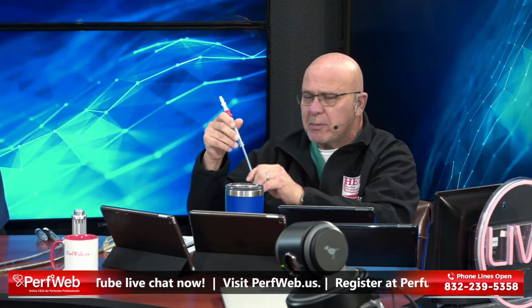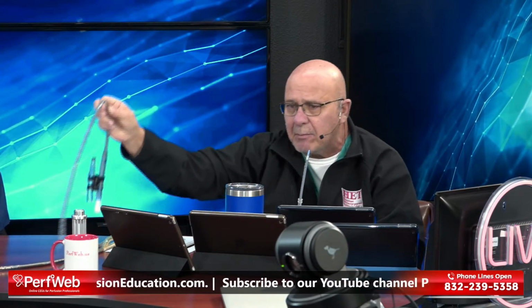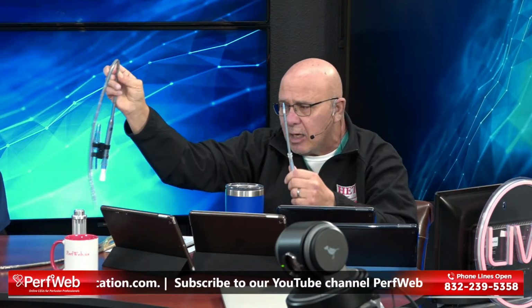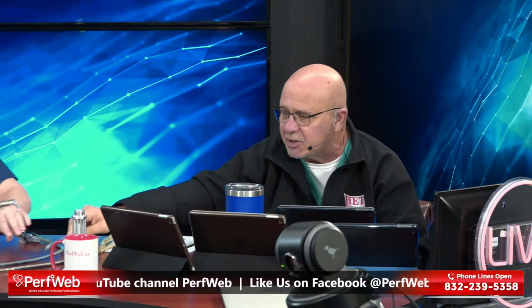And it has a flow dispersement tip, so you would be draining inferiorly, returning superiorly, and it would, of course, be entering the right atrium, and you would have your VV ECMO in that configuration. But this is also how you would do VA. You would have the VFEM in the femoral vein up into the right atrium, and this into the femoral artery. So when you do VA ECMO, it's always going to be a double cannulation or dual cannulation strategy.